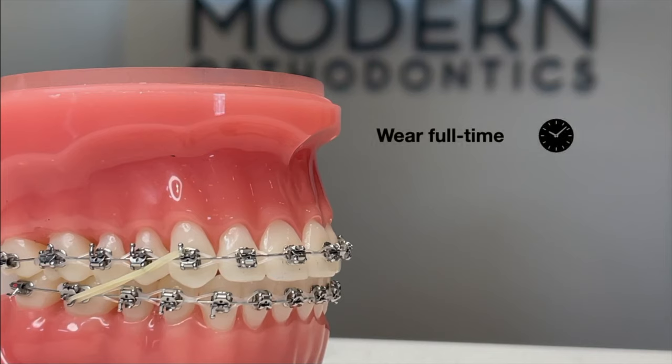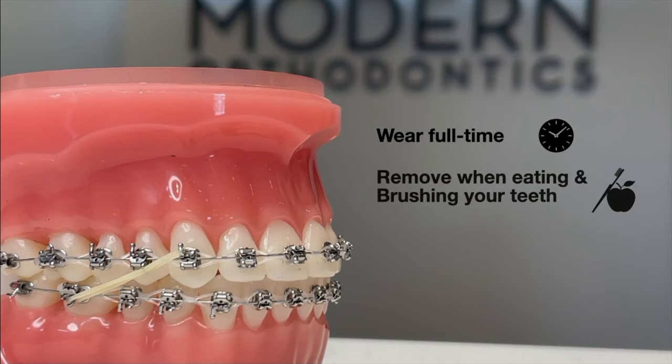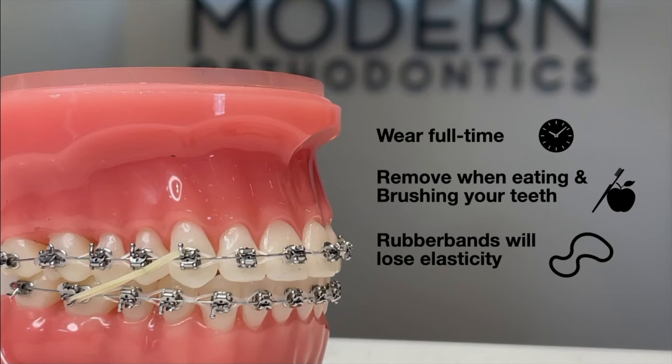The rubber bands are generally kept in your mouth full time and only to be removed when eating or when brushing your teeth. However, the rubber bands over time lose their elasticity and force level, which is why we recommend changing them every 4 to 5 hours or after every meal to ensure the elastics stay effective.